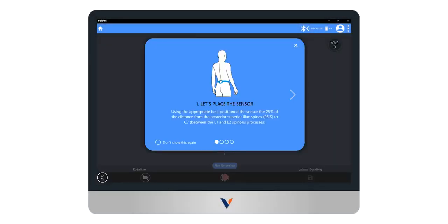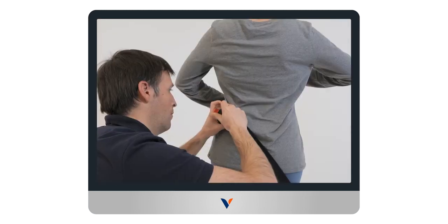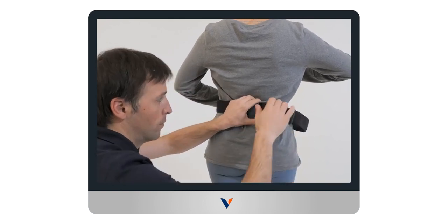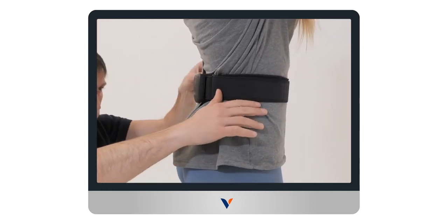As shown by the pop-up, to obtain reliable and repeatable data during the execution of the test, it is necessary to correctly position the sensor on the subject to be evaluated. For the trunk test, the sensor must be hooked to the appropriate band and securely placed at the 25% of the distance from the posterior superior iliac spine to C7, between L1 and L2 spinous processes.